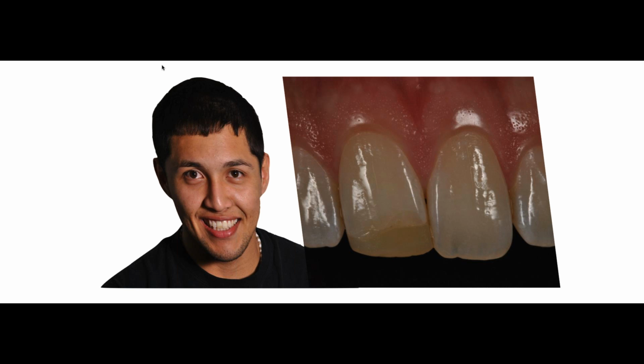But one of the things that I want you to see, and this is another specific way that you can use dental photography, is to look at the neighboring tooth. Look at tooth number 9, and look at all the halos, all the shadows that you have on the incisal third. Look at the hypocalcification spots that you have everywhere, white spots. Look at the gray. Look at how much information, how much intrinsic shades this tooth has in its incisal edge.